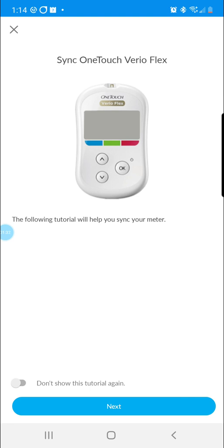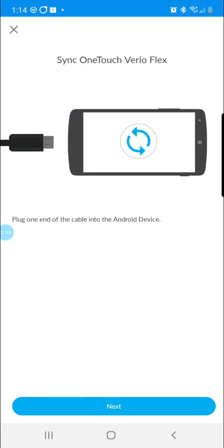Next, it will walk you through a tutorial that will help you sync your meter. So from here, we will click on next.